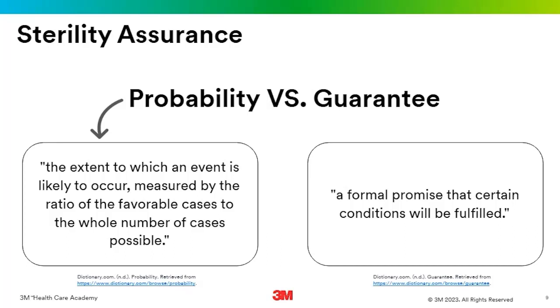That's because in sterile processing, we don't operate under this idea of a 100% guarantee. So even if we had SAL, good old Sal, he went up to -8, -9, it would still never become 100%. It would just get that much closer every single time.